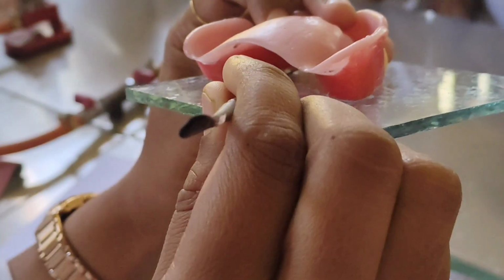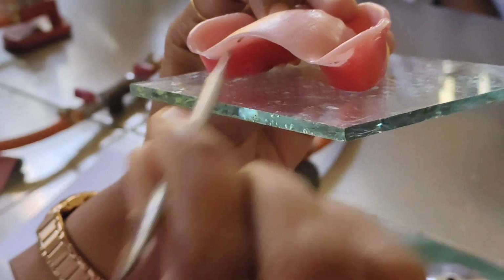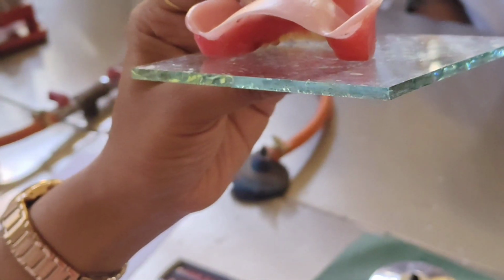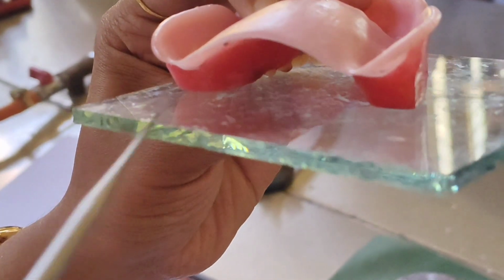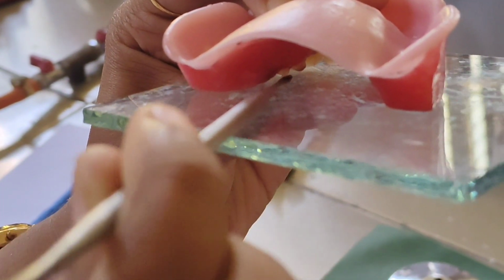If you see carefully, this is touching. Here I can pass the instrument for the first premolar palatal cusp. It is not touching. Here this is not touching, this is touching.